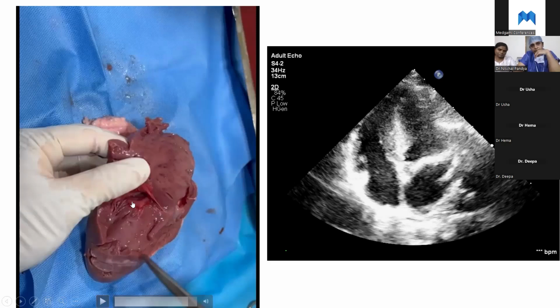If you think that this is the crest, till somewhere here, just along the crest are our bundles again. So the right bundle, we try and keep away from here. So we take sutures that come off somewhere here. If the margin is here, we're at least 5 mm away from it, and the patch sits on the RV surface.